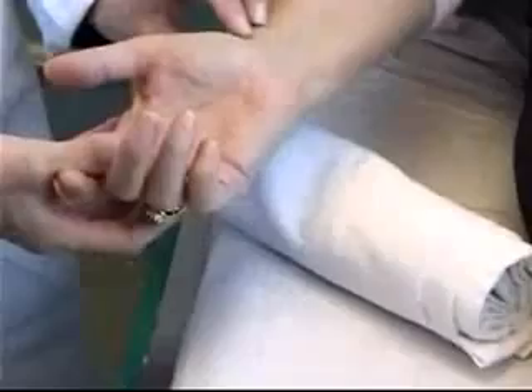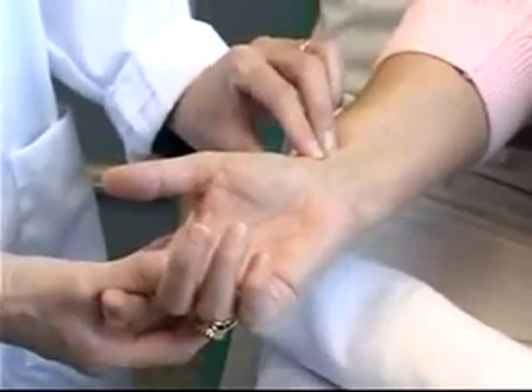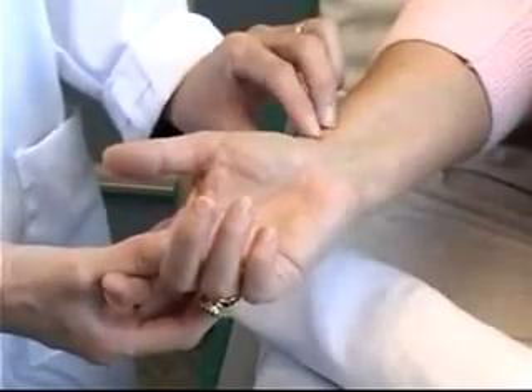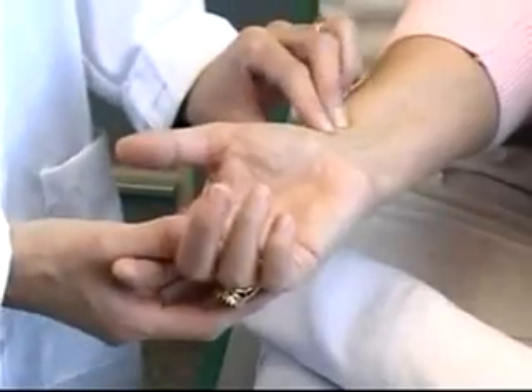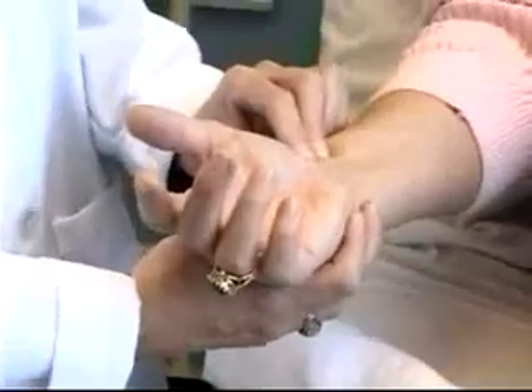We'll begin the procedure by performing the Allen's test. The most common site chosen for blood gas sampling is the radial artery of the non-dominant hand. Once you've chosen the hand, before you can proceed, you must first perform an Allen's test, which indicates whether or not there's collateral circulation to the limb.